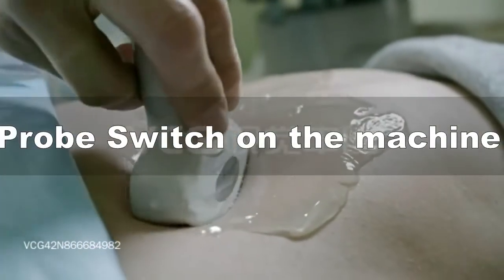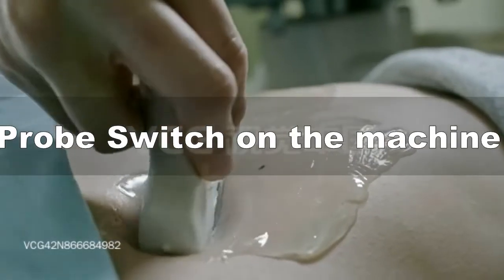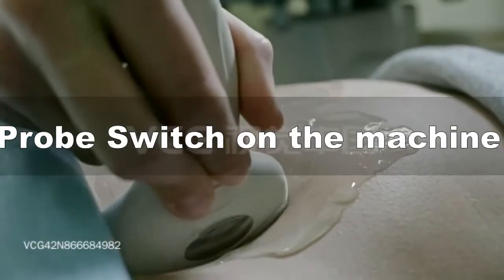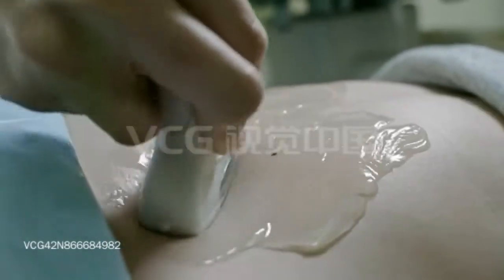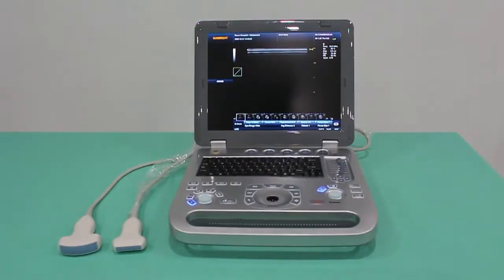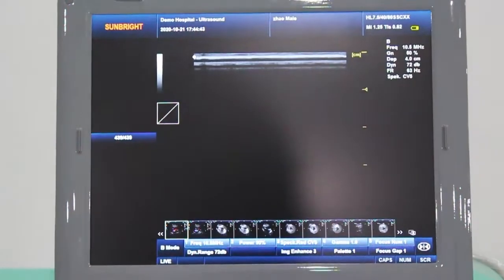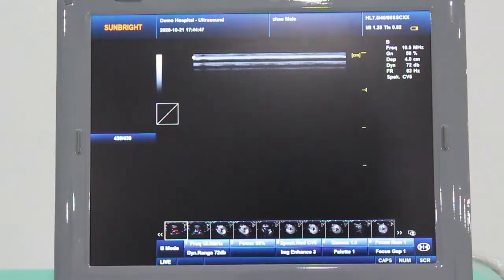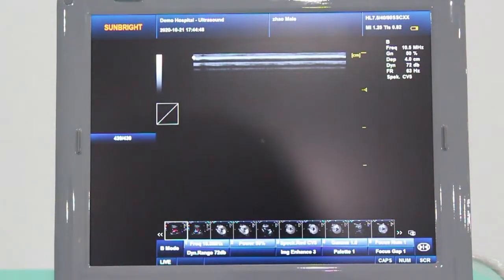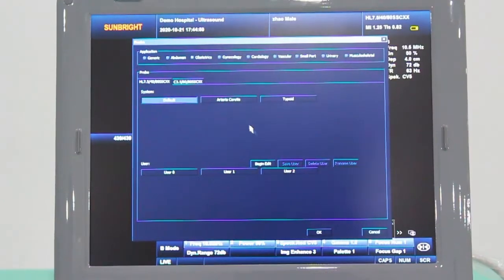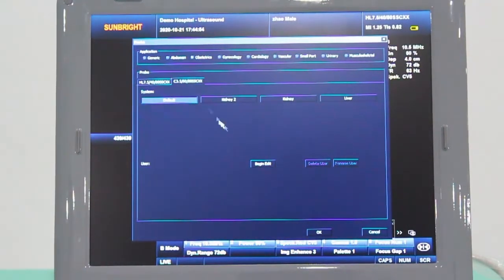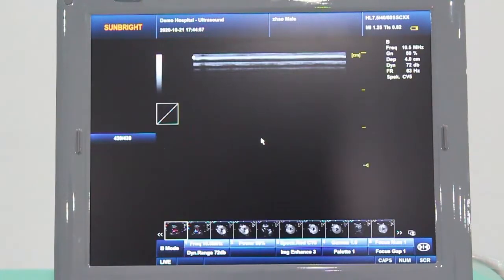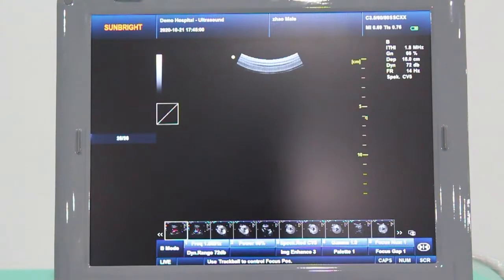To switch the probe on the machine: Press the probe option and choose the probe you want, then press OK. The probe is changed successfully.